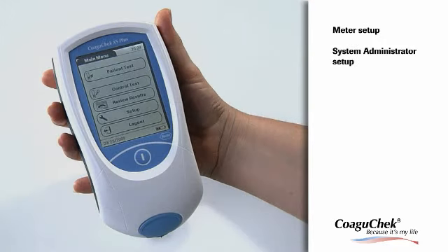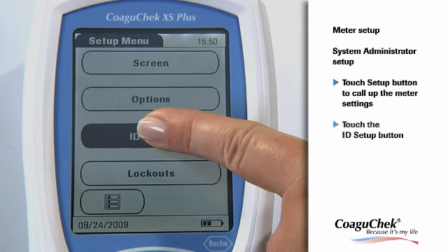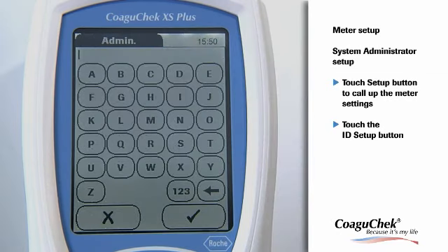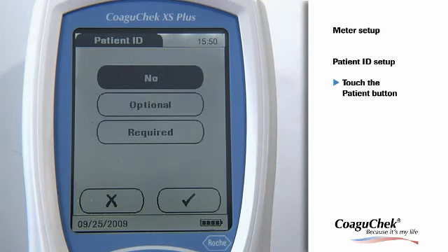The next setting option is important to assign authorizations for user management and patient management. To select these functions, please touch the Setup button and choose ID Setup. The administrator has special rights to enter certain meter settings. The Operator function enables you to define qualified personnel using the meter to test patients and collect data. For more detailed information, please refer to your manual.